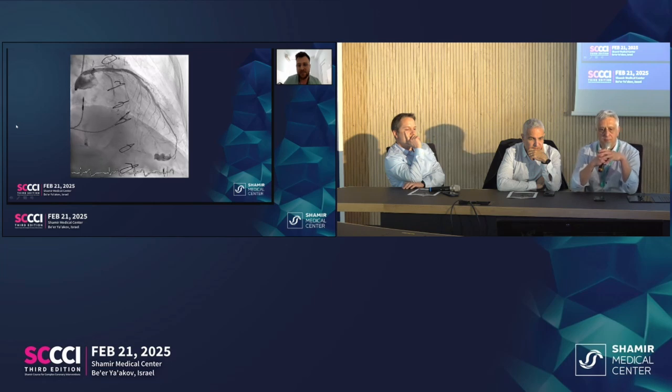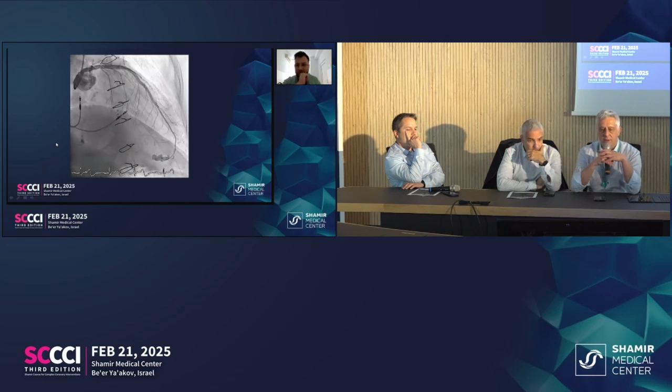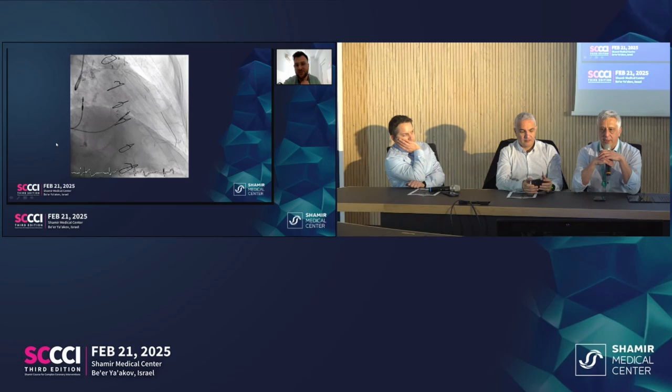It can be the vein, but you can see the part where the staining is, and you can see the staining, but you can also see then a bit of spilling at the end of the staining here. No, but I mean, you can put the coils, but if it's a large cavity, the coils will just flow with the flow further. Exactly. Would you put a coil, or is that a risk of actually embolizing the coil somewhere? You can cut a balloon. You can put an umbrella.